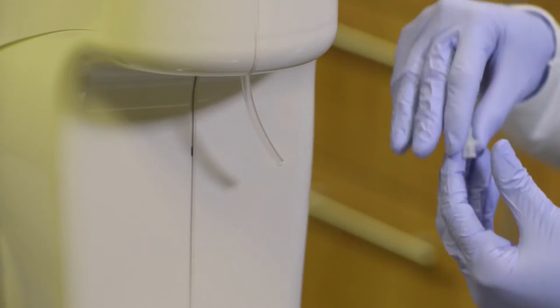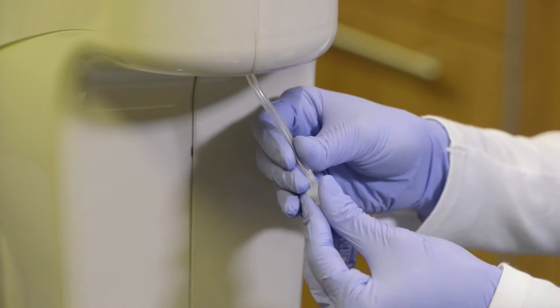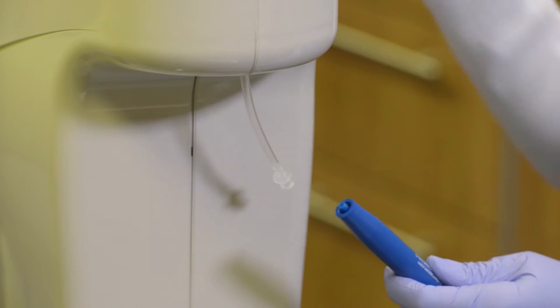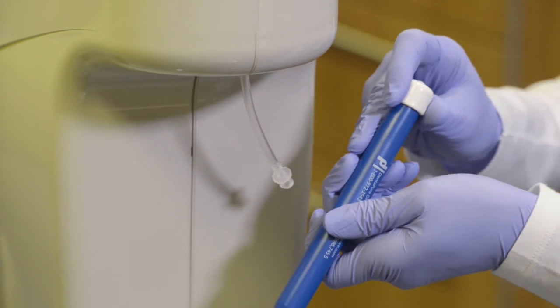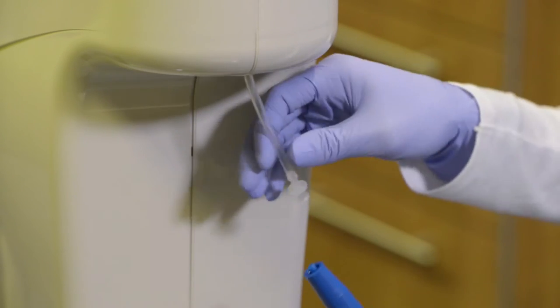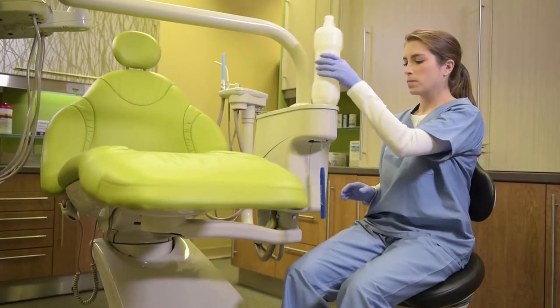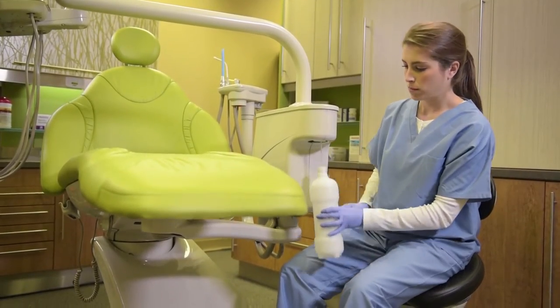and securely insert the included fitting. Take off the white protective end caps and attach the cartridge with a simple twist. Fill the bottle with water and return to manifold.